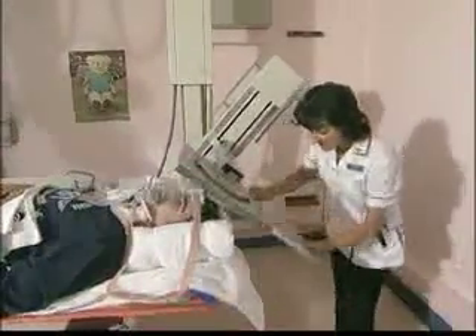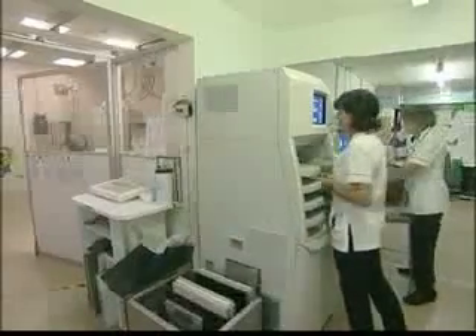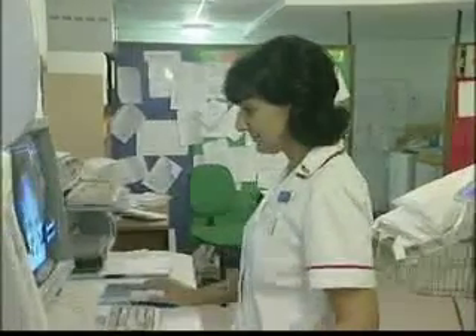OK Alan, well done. After exposure, the cassette reader converts the intensity of each element of the phosphor array into a digital record.